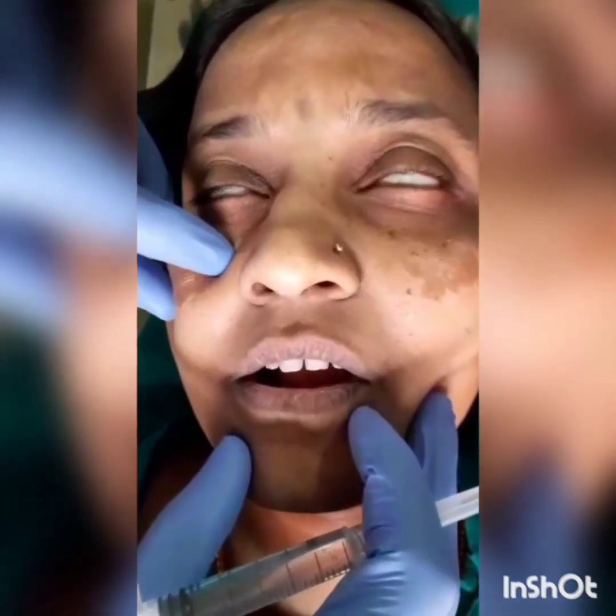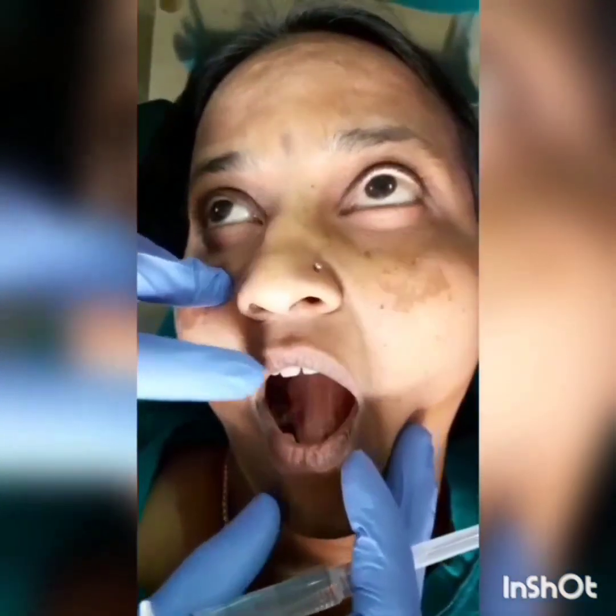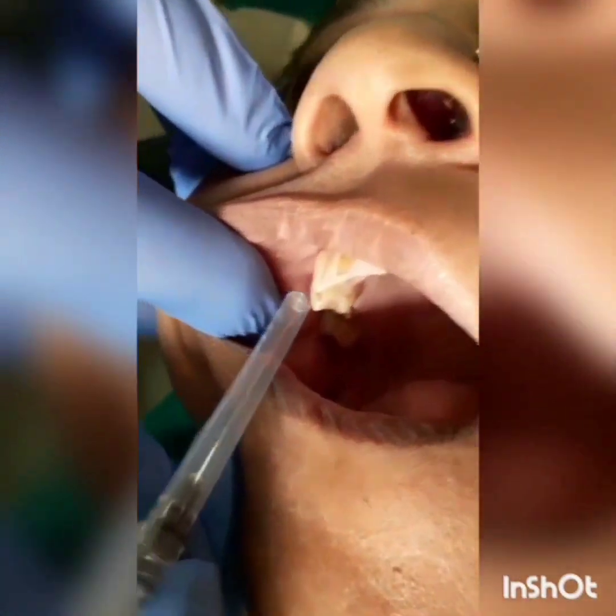For the infraorbital nerve block, the landmark is the infraorbital rim. Then we get a small notch here. If you move the finger down from the notch, you get the depression. That depression is the infraorbital foramen. When you compress the foramen area, the patient has soreness and pain in that area, so that is one landmark. Then intraorally you see the premolar areas.